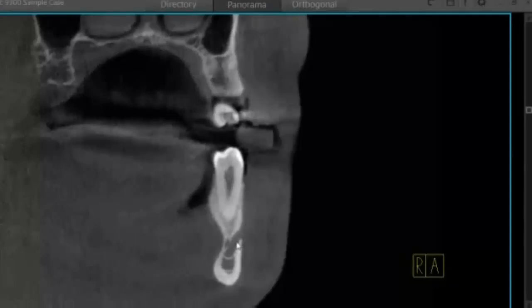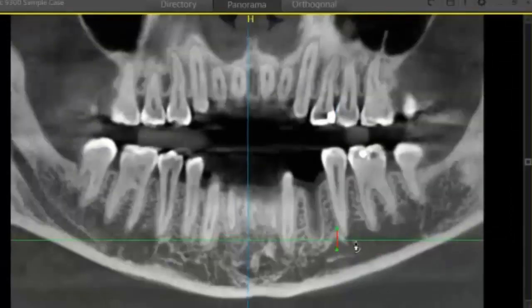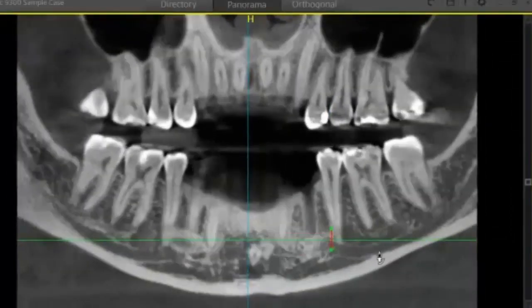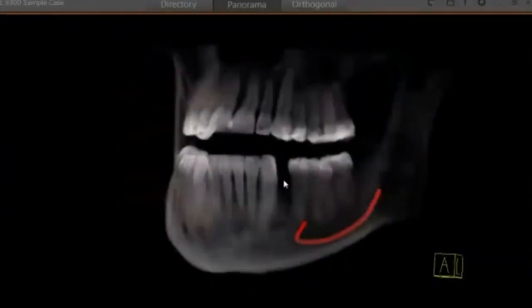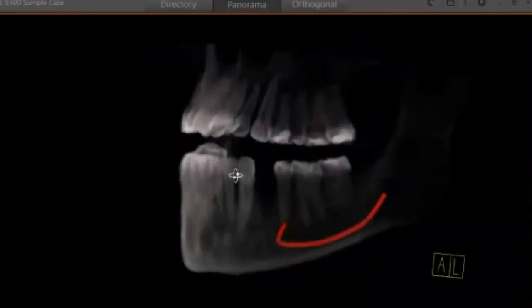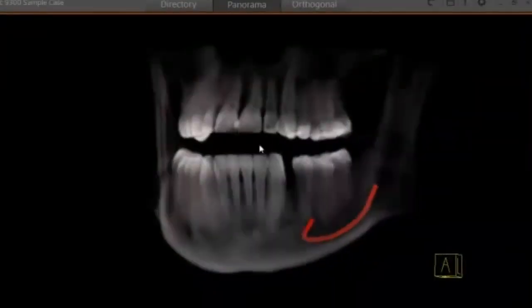You can see where our nerve starts. I'm going to select my nerve drawing tool, place my points, and then jump back to the pan to finish it out. And we're finished. You can jump over to your 3D volume to take a good look. We're ready to plan our implant.